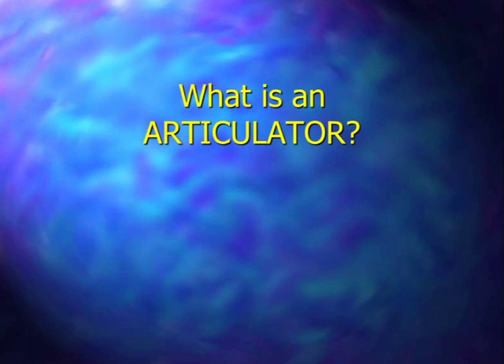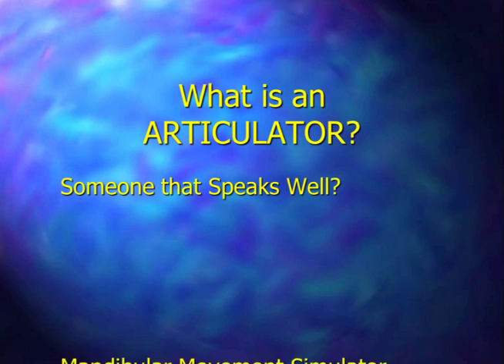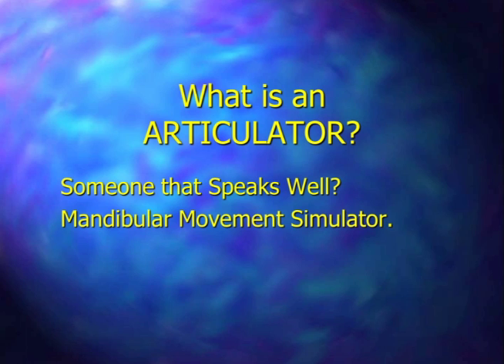Well, what is an articulator? The average person might ask if that's someone that speaks well. Dentists often refer to them as mandibular movement simulators. I like to simply state that they're chewing simulators. What we're trying to do with an articulator is to simulate the way someone chews, which is a very dynamic three-dimensional movement that includes an opening, protrusive, lateral, and closing movement.